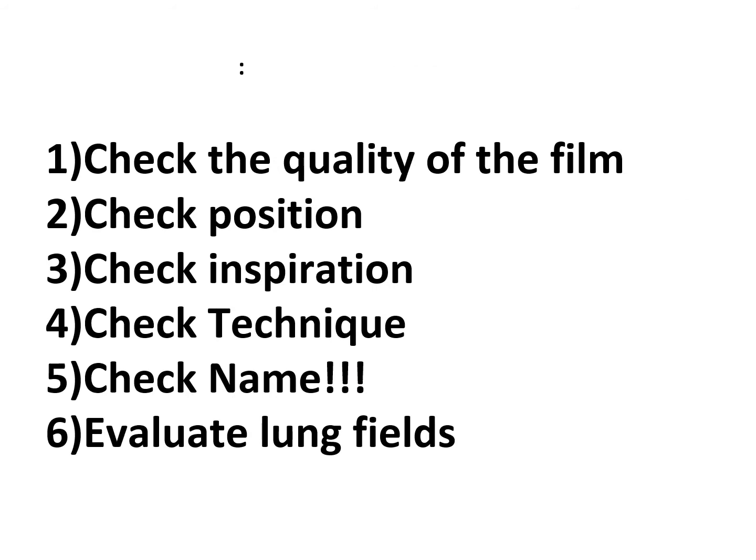All right, the other thing with fluoro is that they use it for bronchoscopies. They use it for the peripheral EBUS or the radial bronchoscopy. So I'm sure you'll definitely see fluoro being used. It's fairly popular. So when we're looking at an X-ray, we have little steps, I guess.